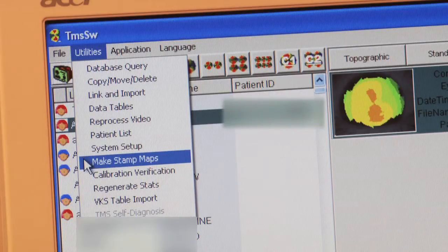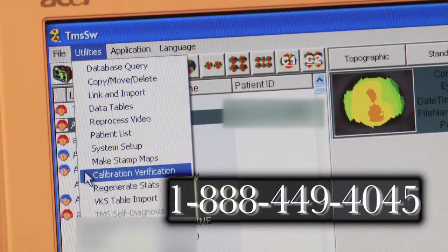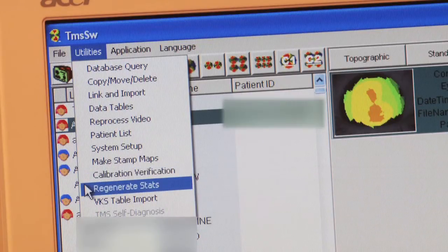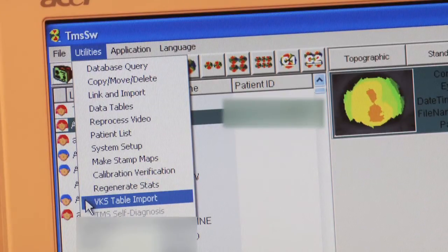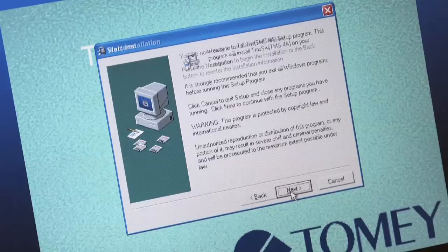Make Stamp Maps. Calibration Verification — we recommend this procedure be performed with the assistance of our toll-free tech support line. Regenerate Stats. VKS Table Import — this selection is vital to the operation; nothing can be done without the VKS files. These files are installed at the original startup installation.